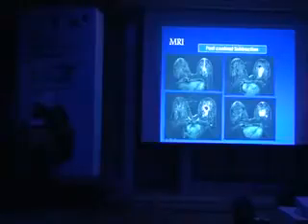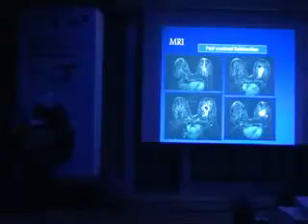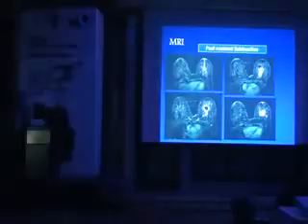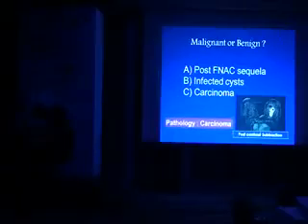You take very nice pictures and that's it, okay, multiple cysts. No, be careful. Cancer can arise among these cysts. Any lady who has multiple cysts is not immune to cancer. And quite often we just neglect to see multiple cysts and that's it, fibrocystic disease. Please take utmost care. This is very troublesome, and sometimes you find it difficult and time consuming to perform the study. But anyhow, this proved to be a carcinoma. Sure it is. An invasive duct carcinoma.